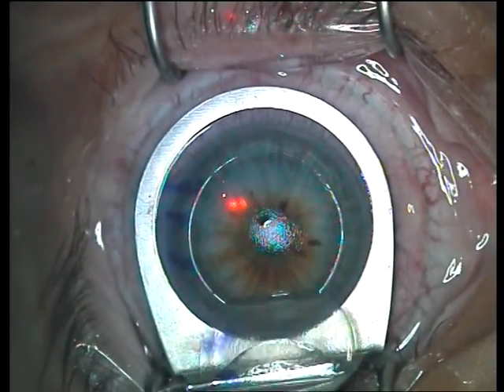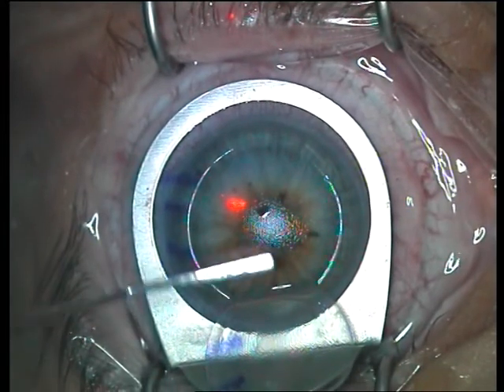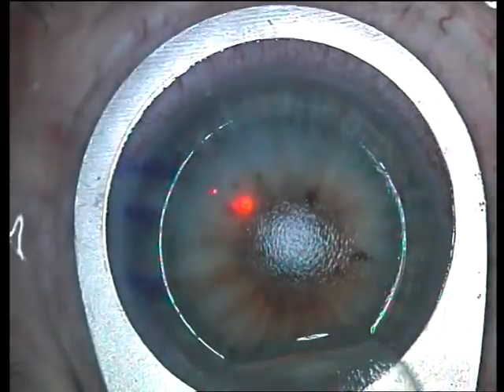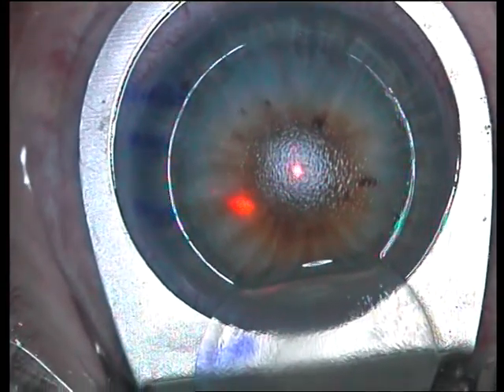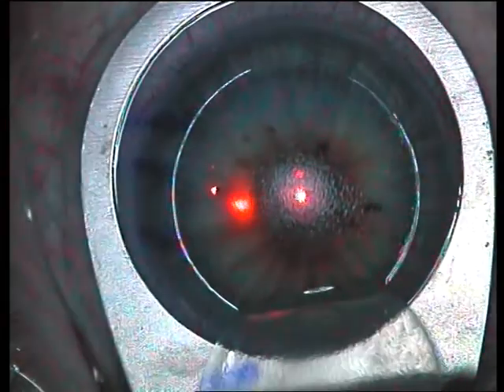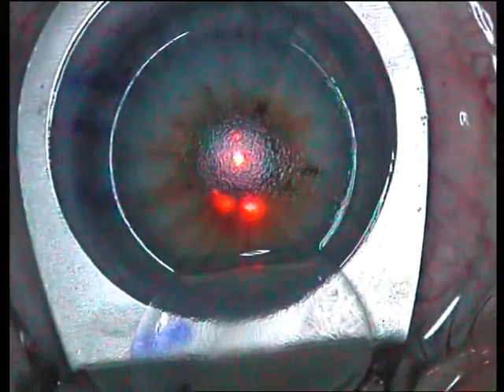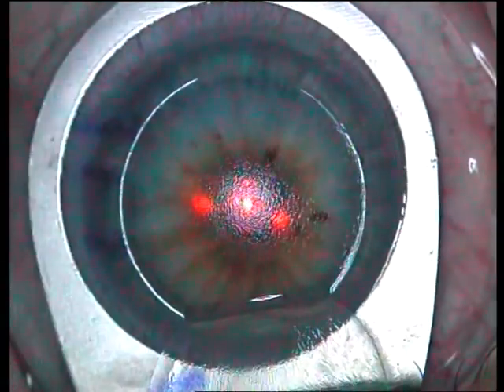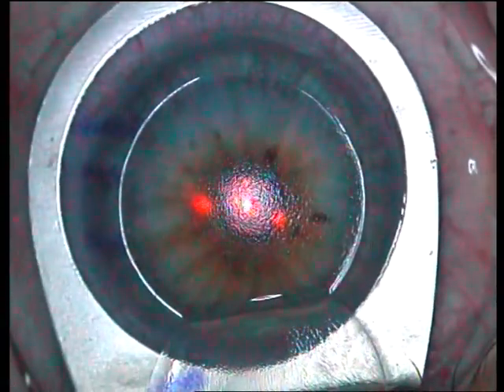The flap is repositioned and allowed to rest on the platform of the flap rest. You saw me remove that small drop of water from the bed — that is absolutely essential. If that is not done, you will most certainly get a central island after this procedure, and central islands are not treatable by any conventional means of LASIK.